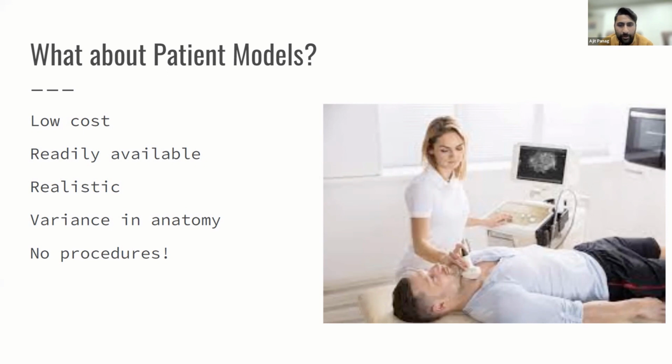So kind of my own personal philosophy that I talked about already. I think simulation probably isn't the best for non-procedural modalities. To get good at looking for the aorta, for example, you can't simply scan your medical student and resident peers who are statistically more likely than our patients to have normal anatomy, lower BMIs, et cetera.